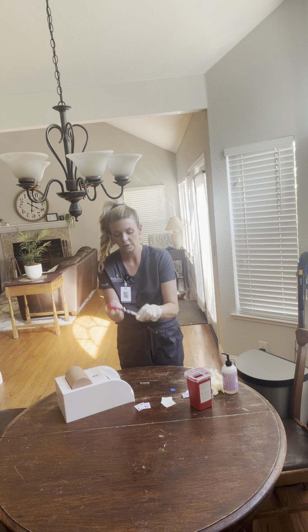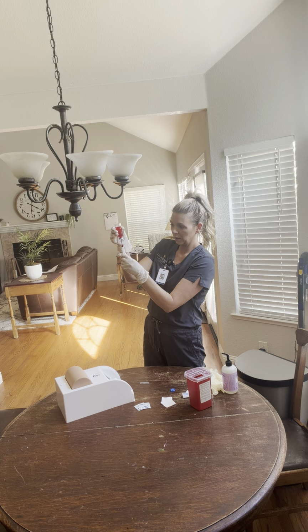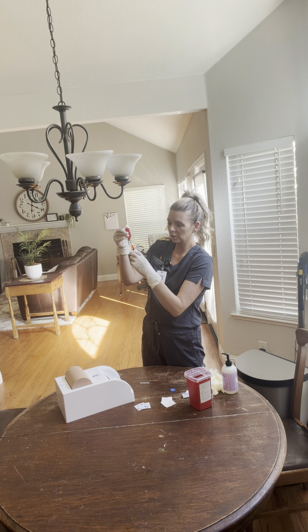I'm going to invert, and I'm going to make sure that I'm not getting any air bubbles, and I'm going to slowly get to 0.5 milliliters. And it's okay to go a little above so that you can flick the air bubbles out and make sure that you are getting the correct dose with no air bubbles.